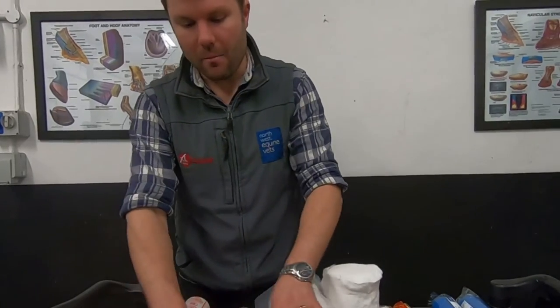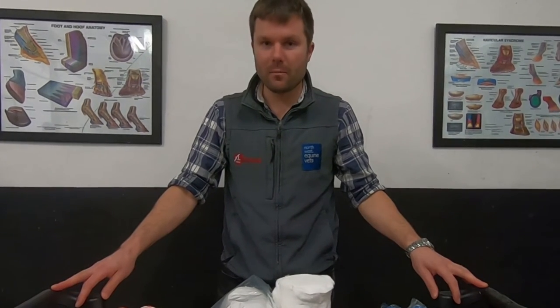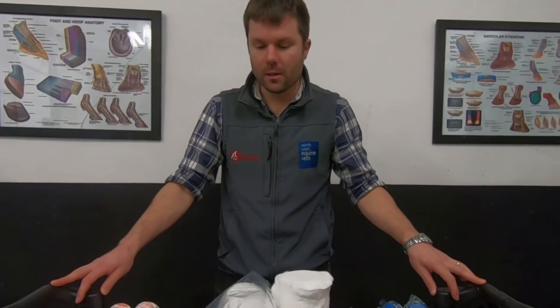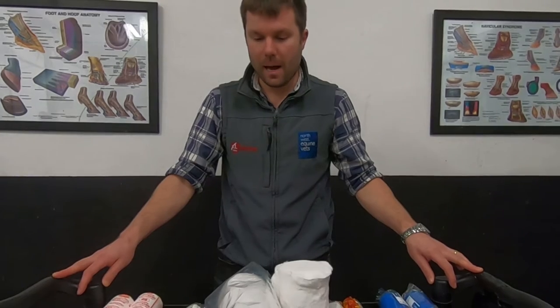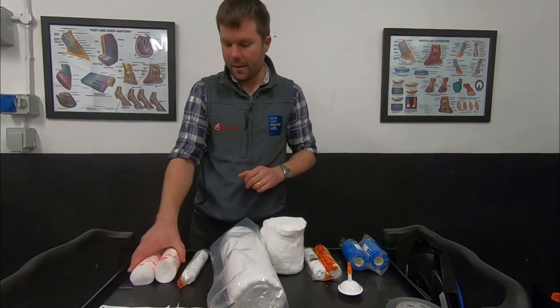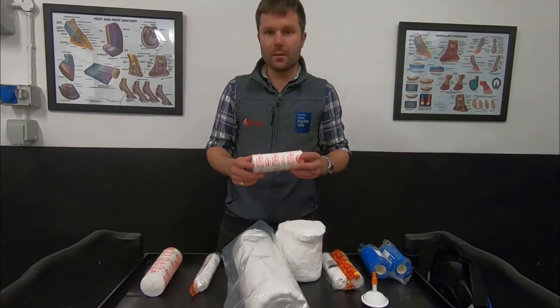Having applied our primary dressing layer, we then want to apply padding. The key with any bandage is plenty of padding — it's very easy to apply bandages too tight and cause more problems than you've already got if you don't have sufficient padding. Our second layer, after our dressing layer, is normally one or two of these — ortho bands or soft bands.